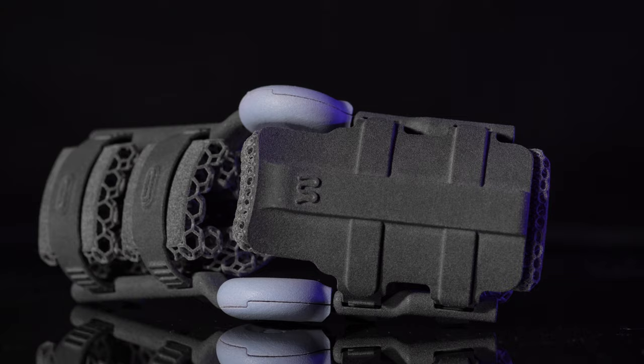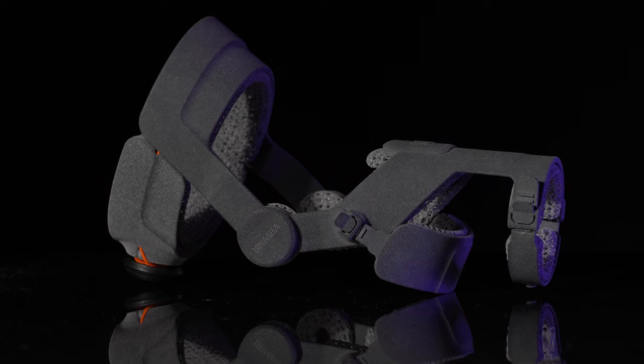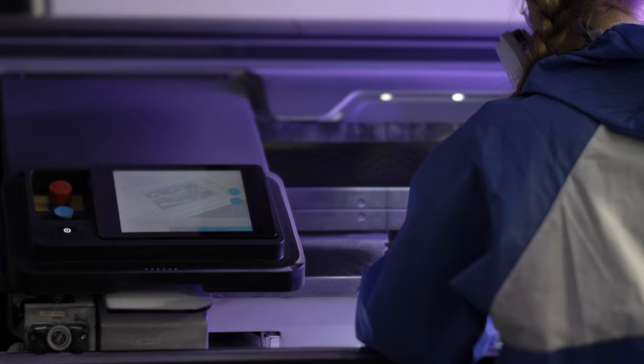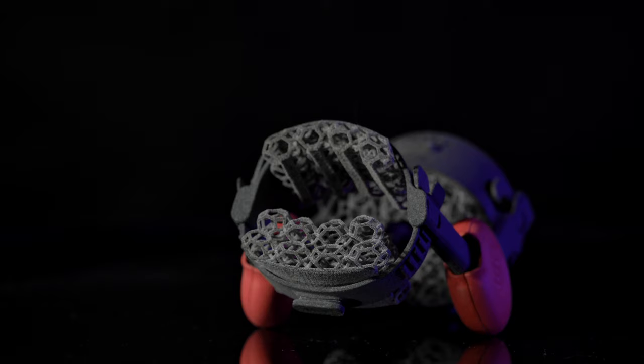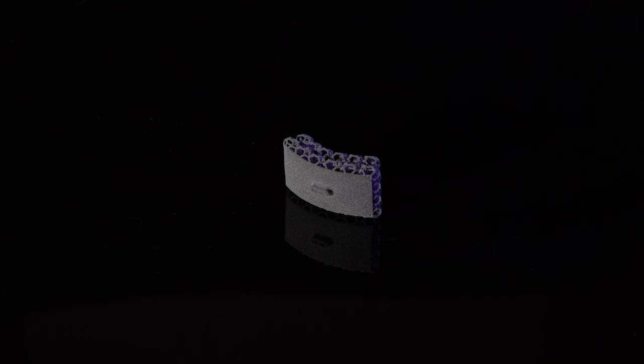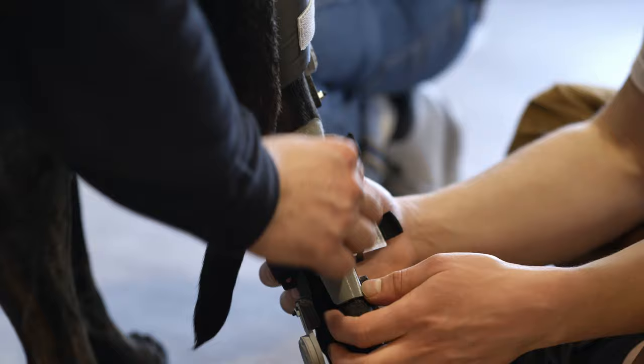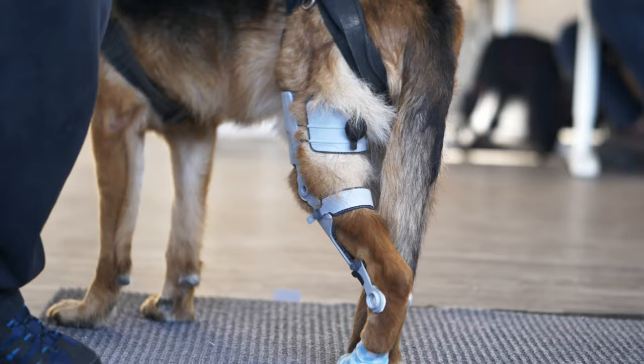Combining our 15-second scan technology with a shape acquisition algorithm, we could get rid of the problematic casting in orthotic production. Adding revolutionary foam printing, we have designed and incorporated into Wimba orthotics a sophisticated cushioning system, which nearly eliminates pressure points. Unlimited customization of Wimba orthoses has opened up a new chapter in how orthoses can change clinical outcomes of our patients — all of this combined into the most advanced orthotic devices ever available.